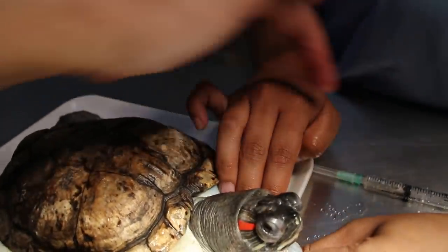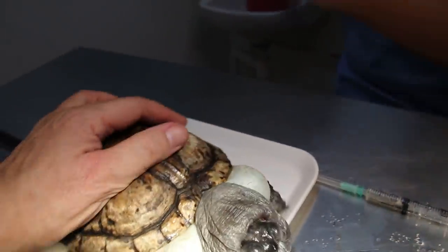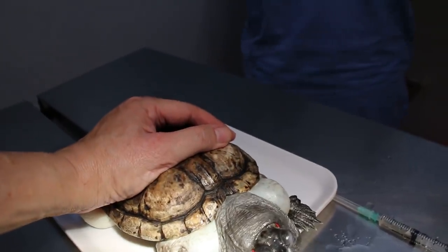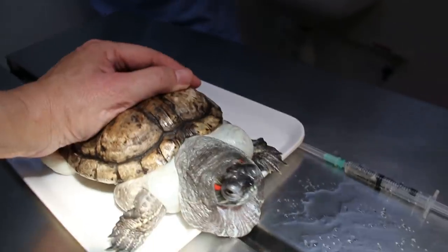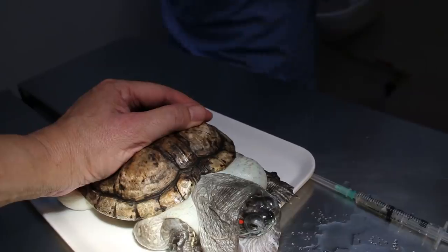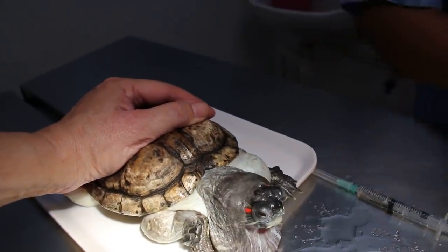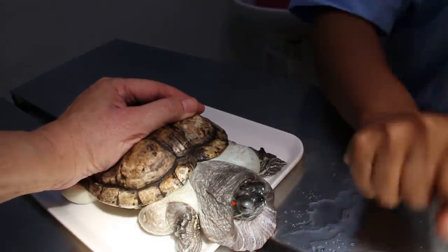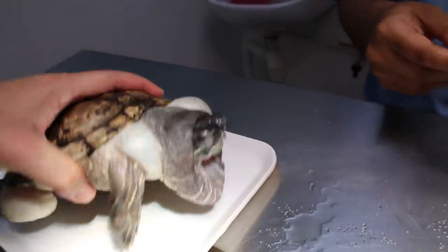We take a new needle. We will do this side — we try this side first. The green one. Take out the water, so let the fluid out. Again from the ventral.